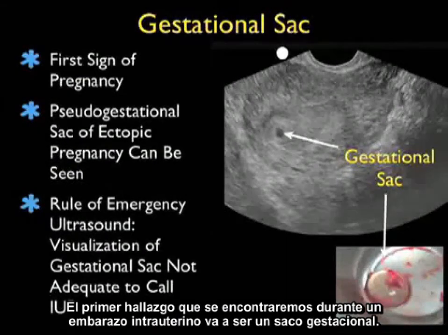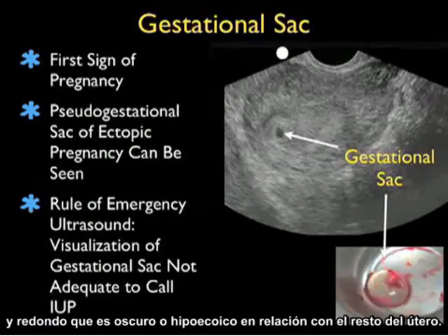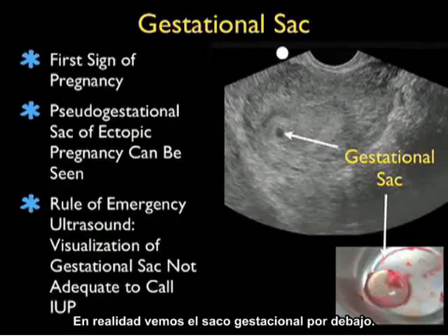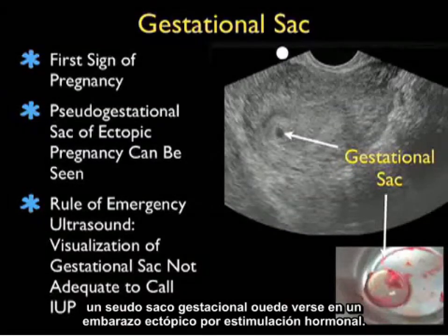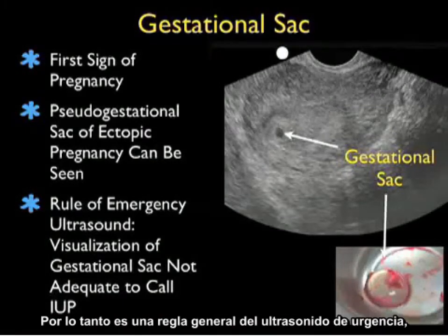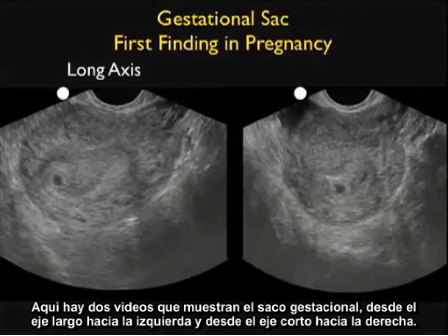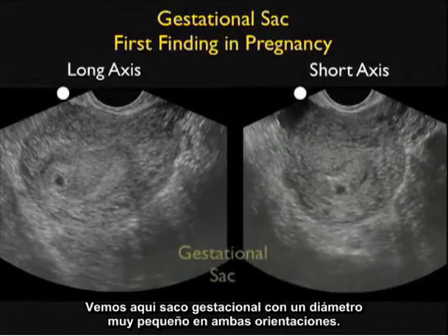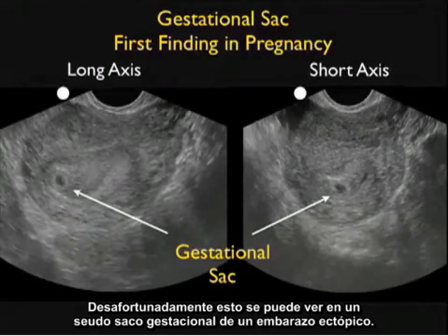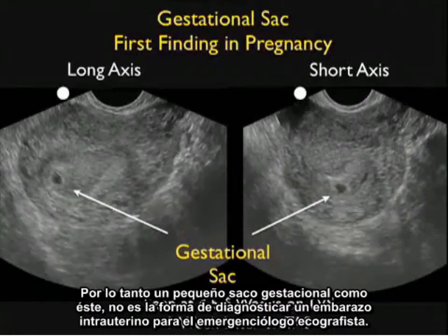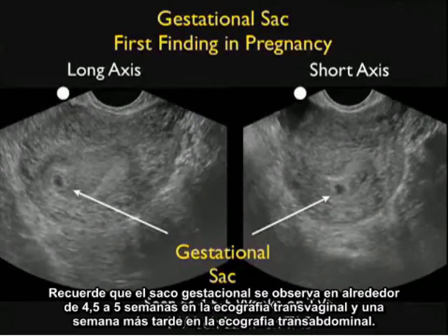The first finding during an intrauterine pregnancy is the gestational sac — a small round circle that is dark or hypoechoic relative to the rest of the uterus. Unfortunately, gestational sac alone is not diagnostic of an intrauterine pregnancy, as a pseudo-gestational sac of ectopic pregnancy can be seen from hormonal stimulation. Here are two video clips showing the gestational sac in long axis and short axis — a very small diameter gestational sac seen in both orientations. A small gestational sac like this is in no way diagnostic of an intrauterine pregnancy for the emergency physician sonographer. The gestational sac is seen at about 4.5 to 5 weeks on transvaginal sonography and about a week later transabdominally.